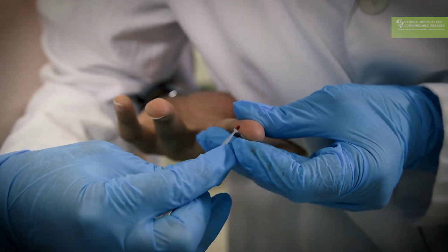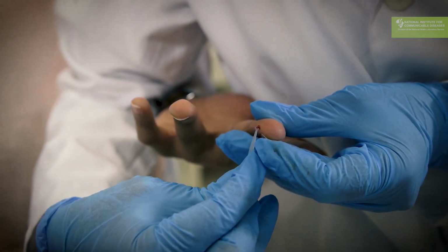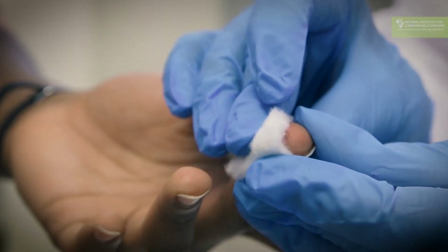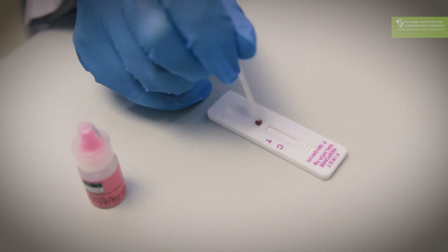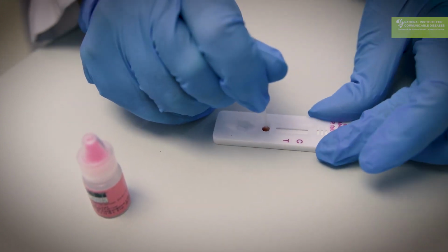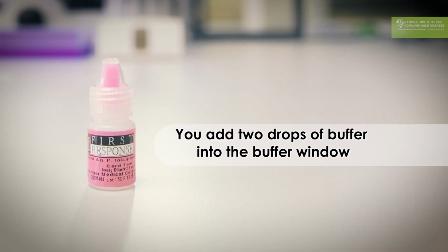You collect. The pipette has a cup which ensures you collect enough blood. So you take the blood and you put it into the blood window of the RDT, and that's all the blood that you require. And you just add 2 drops of buffer into the buffer window.